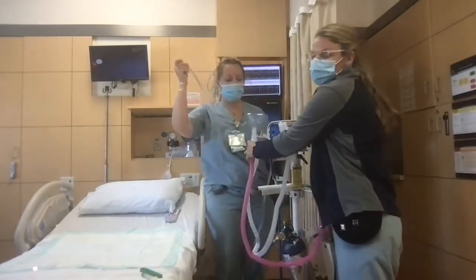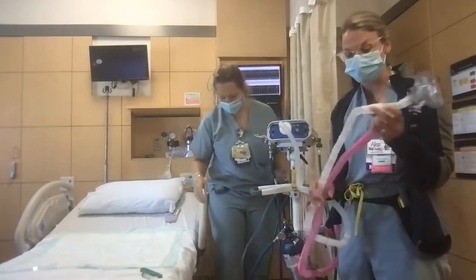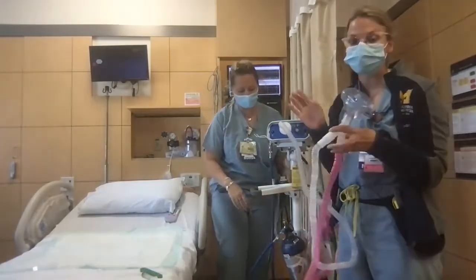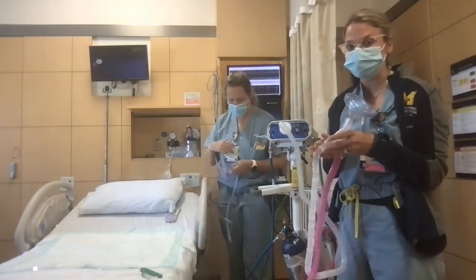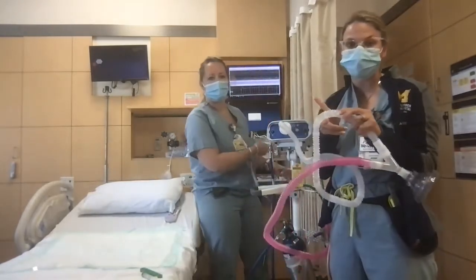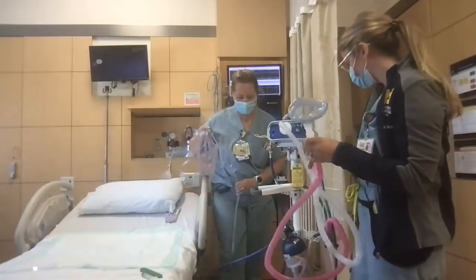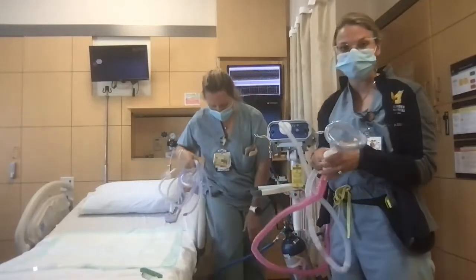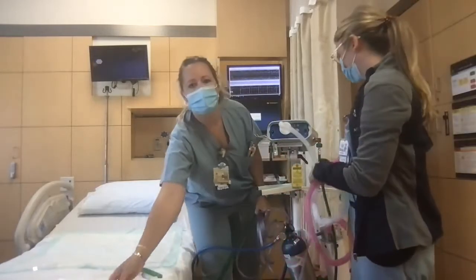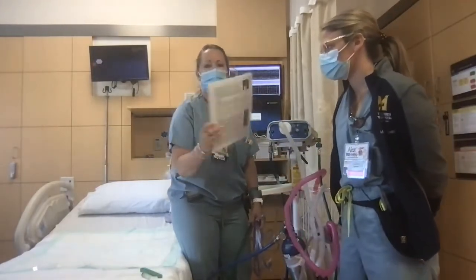If the patient could potentially be using nitrous again in the future, you want to save this mask and tubing, you would put it in the locked cabinet for future use. If your patient will not be using nitrous anymore, then you want to get a second nurse to again verify, this time that you are cutting your tubing so it would not be improperly used. And that is how you would disconnect your suction, your nitrous. There is also on most of the machines a cheat sheet that helps you with setup.